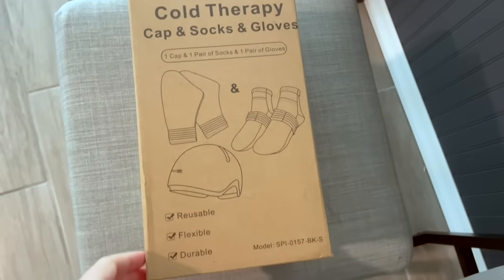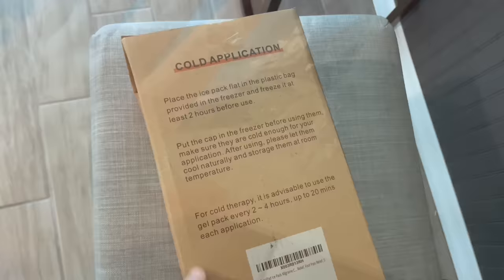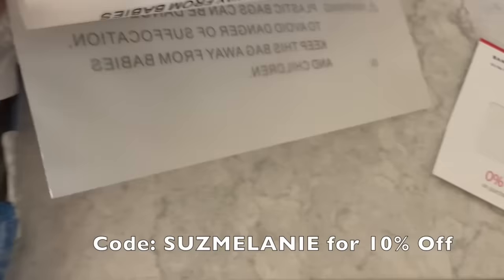This is me getting ready for an infusion day. I had already been using Suzy Pad Cold Therapy to help with neuropathy during infusion days, but they reached out to me to try out their newer pack which also includes a cold cap, and they have offered a 10% off code for anyone that needs Suzy Pad Cold Therapy.